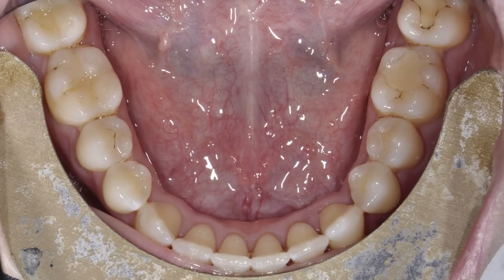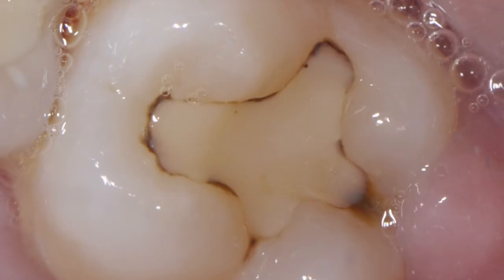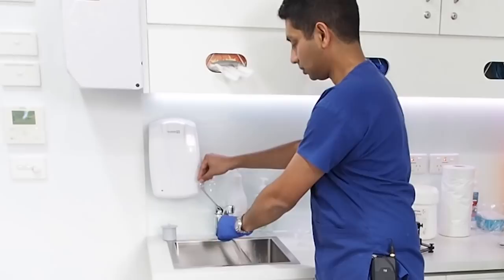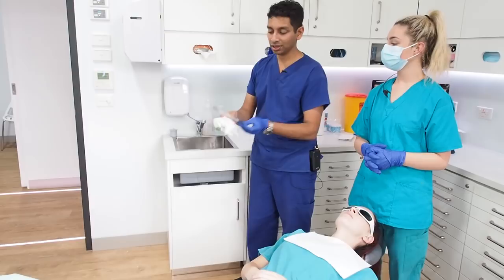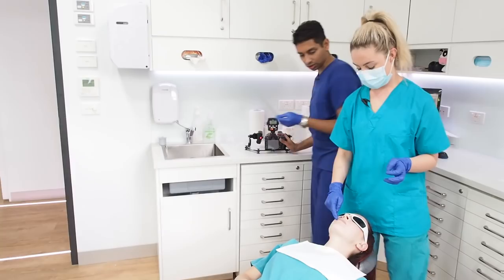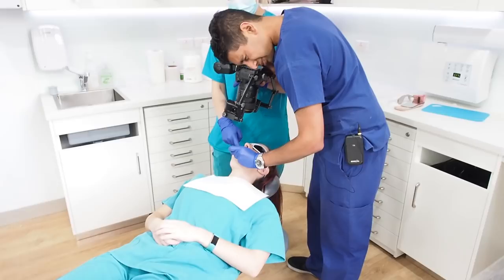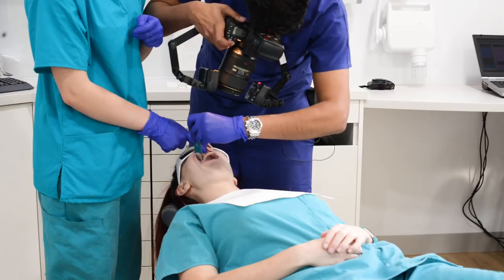That's all the orthodontic intraoral photos taken. Now we're going to take some close-up photos of the occlusals of the teeth. This is better than any intraoral camera — you can zoom in quite a lot and get a lot of detail. Let's give the mirror another heat in hot water so it doesn't fog up. We'll do quadrant one — the occlusal, the palatal in case there are cracks, and around the buccal as well.